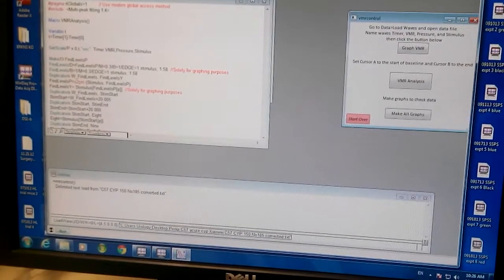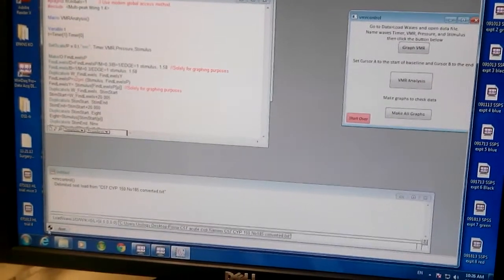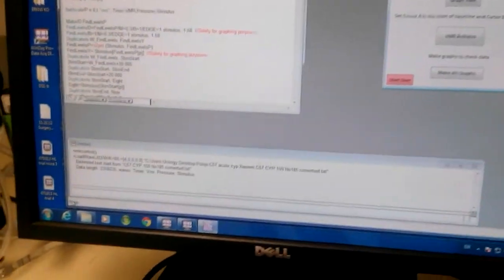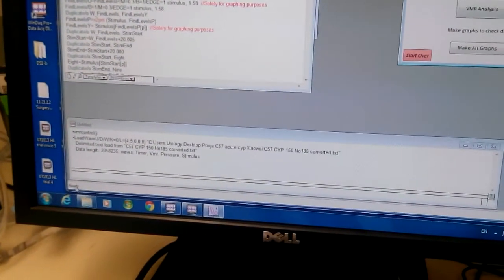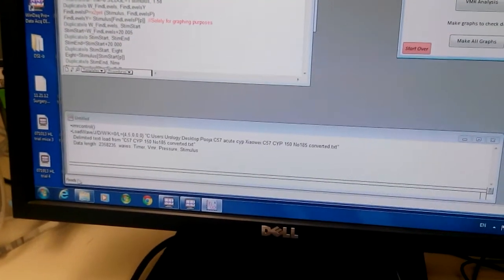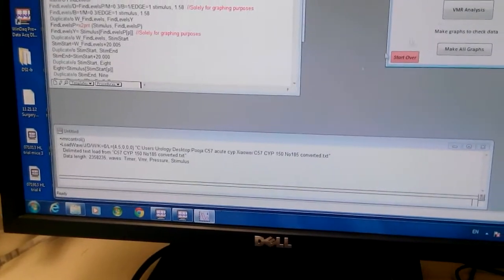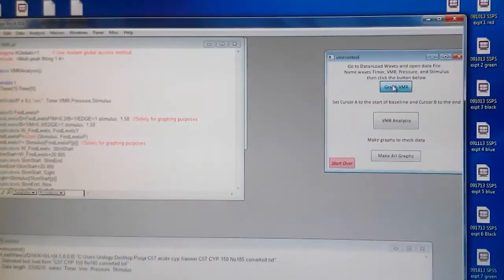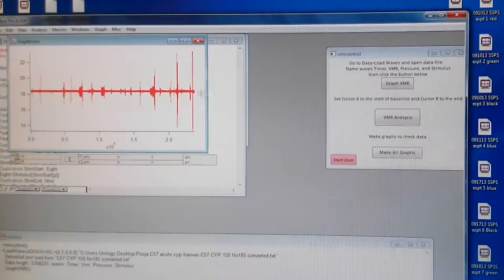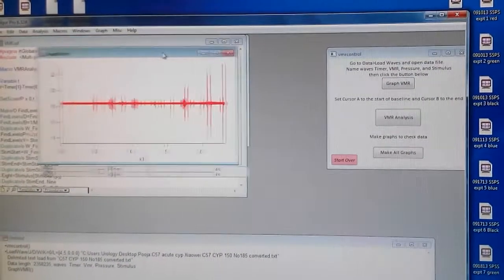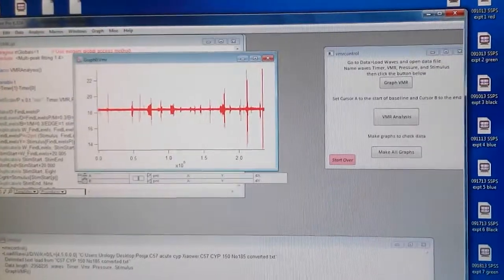You have to watch out for this. Usually there is an error. Now when it says ready, then you can say graph VMR. So here comes your graph.